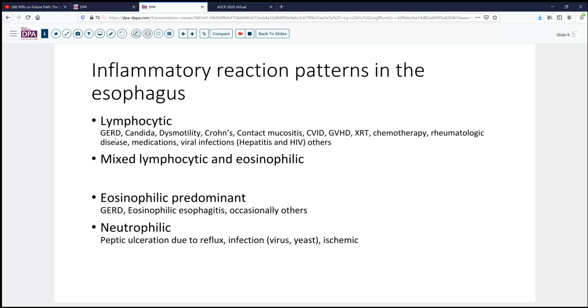If we don't have a sample from the mid esophagus, it's virtually impossible to distinguish eosinophilic esophagitis from severe reflux. Having both, we can be more confident that it is an active eosinophilic esophagitis pattern. This is a disorder that occurs both in children and adults, though the clinical setting and circumstances may vary somewhat. With children, it's most often related to food allergies, whereas in adults, there may be other factors like drugs and genetic predisposition and so forth.